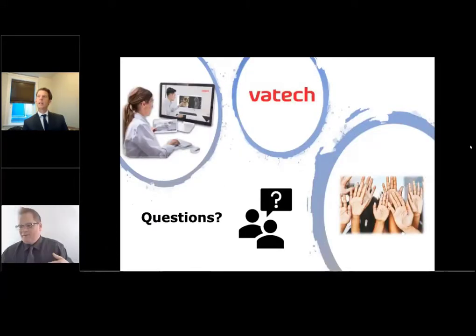All right. Well, now let's get to some questions. Jane is asking, what if I select the wrong field of view in the acquisition screen? How do I go back?